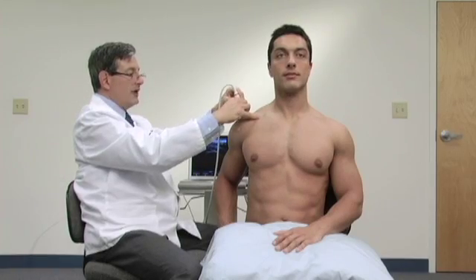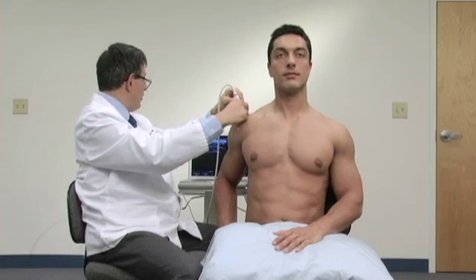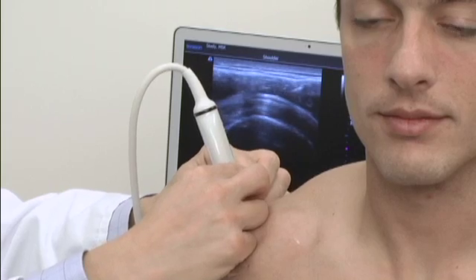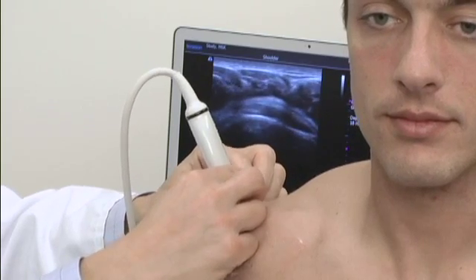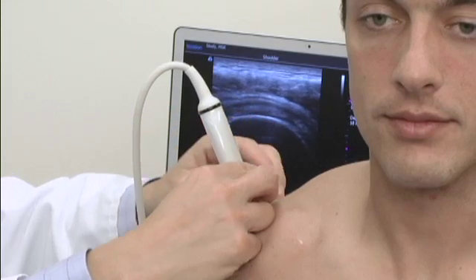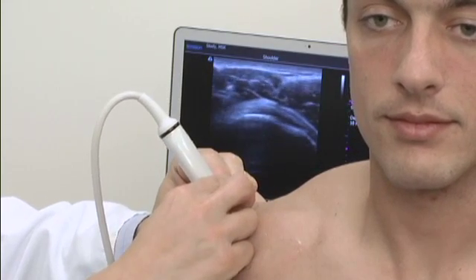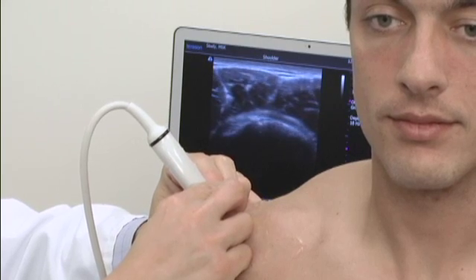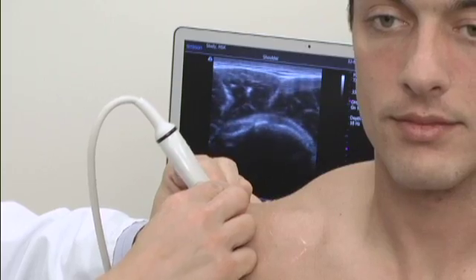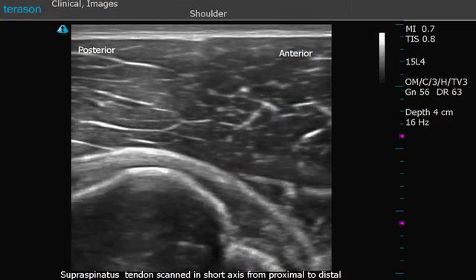Because the tendon is now running in a position like this, we follow it proximally as far as we can. At this point, we are at a very proximal aspect of the tendon where we see the myotendinous junction and some interdigitation of muscle. We'll now move distally to the point where the tendon is joining the greater tuberosity, where we can actually see the shape of the greater tuberosity of the shoulder.